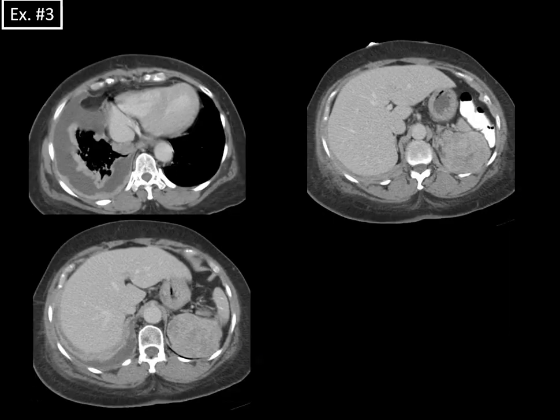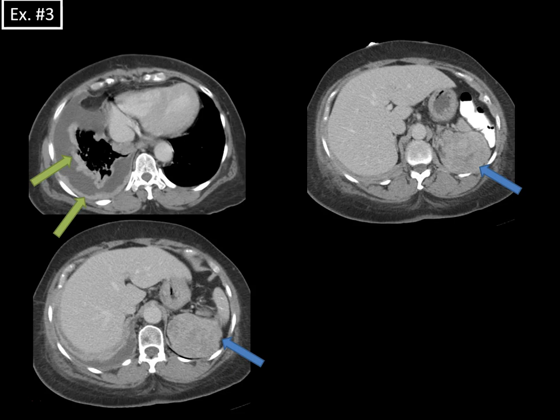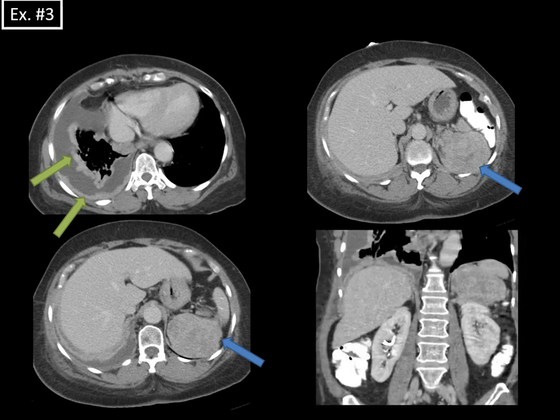Here's another case — a different patient with a large, heterogeneous left adrenocortical carcinoma. There's also irregular pleural thickening at the right lung base. Features of malignant pleural thickening include nodularity, thickness greater than one centimeter, circumferential thickening, and pleural thickening abutting the mediastinal surface — this case has all those features, consistent with pleural metastatic disease. The coronal image shows the large left adrenocortical carcinoma and right malignant pleural thickening with a pleural effusion.